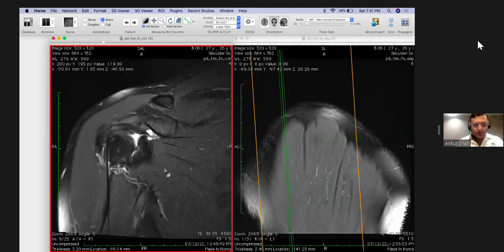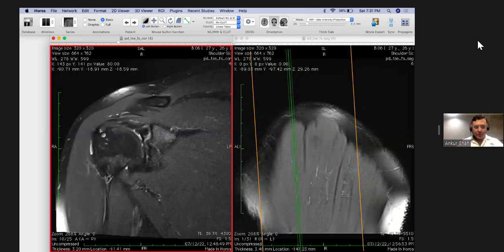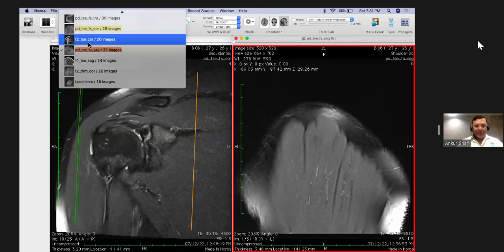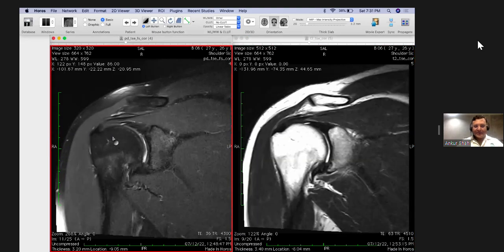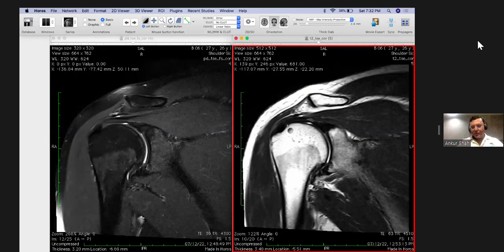Sorry for that. So these are the areas of hyperintensity which you will see in the supraspinatus tendon in almost each and every individual. But what sequence do we take routinely for MR of shoulder? This is the proton density sequence. And we know the PD sequences are susceptible to the magic angle artifact. So look at these changes not just on PD, but always see them on the T2 weighted images also.